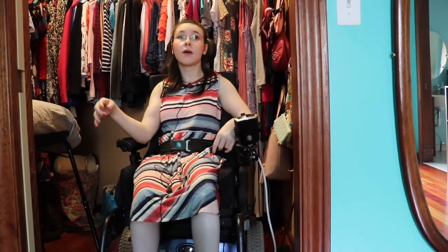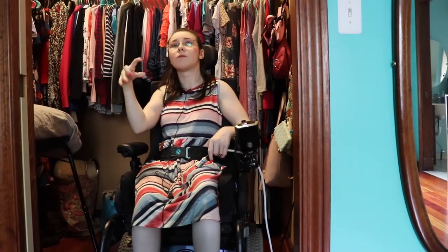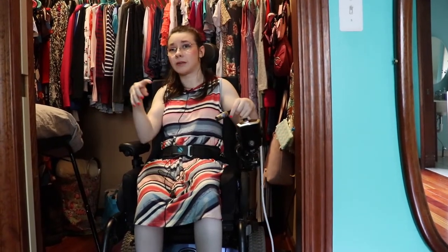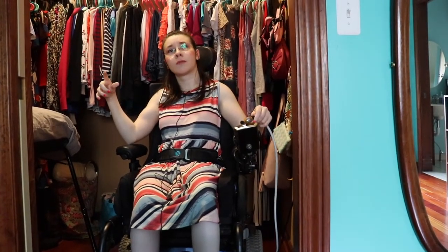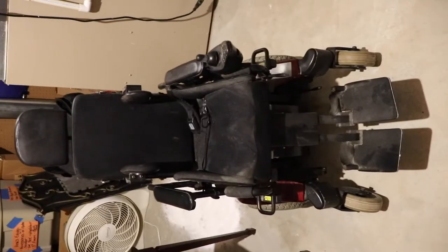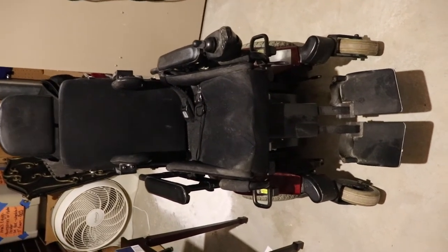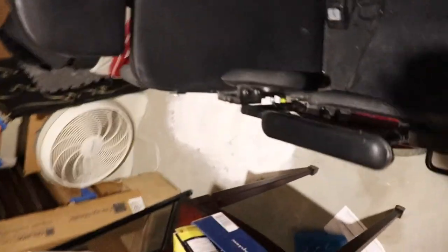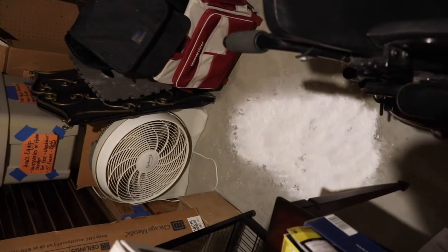We put it in here, and I will put in a clip of how we store my wheelchairs downstairs. We store my wheelchairs that I don't use on a daily basis down in the basement. We keep my wheelchair batteries in the wheelchairs themselves, which is why we have a battery acid stain on our floor.